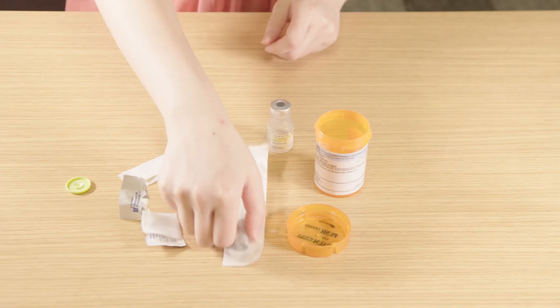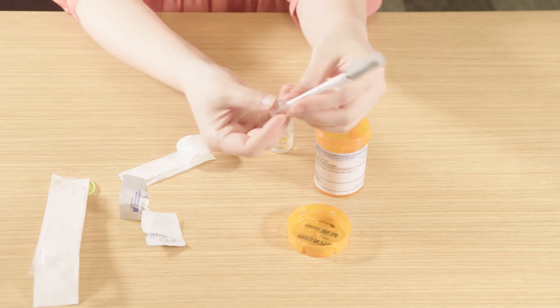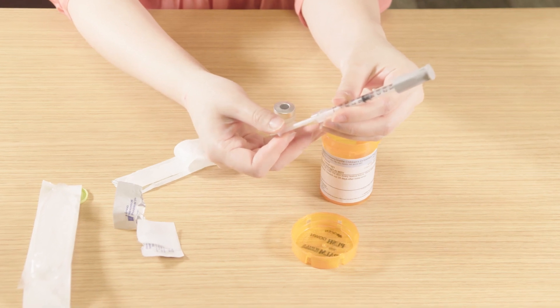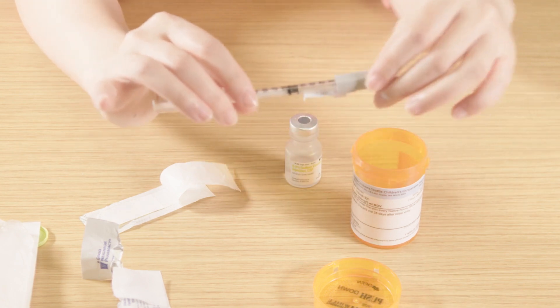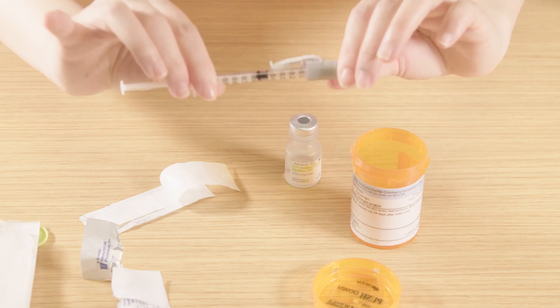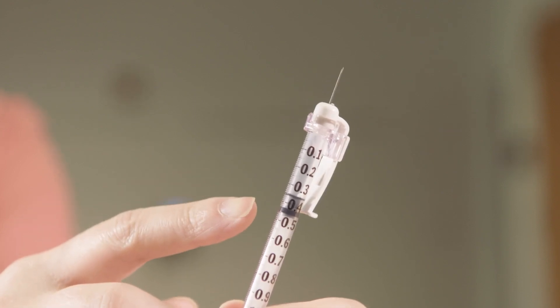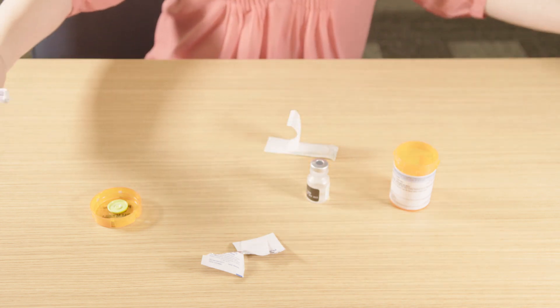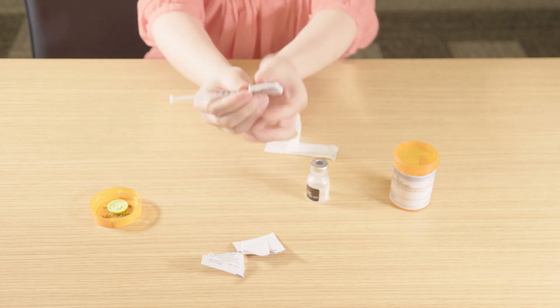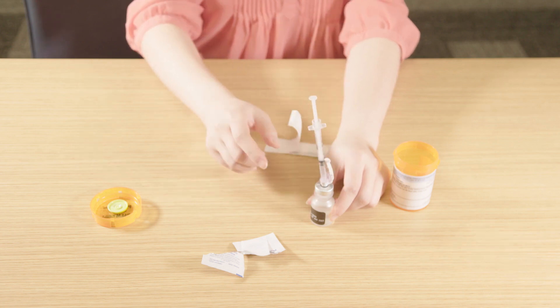Unwrap your band-aid. Next, unwrap your clean sterile syringe — you can use these only once. Pull air into the syringe by pulling back on the plunger. The amount of air should be a little less than the amount of medicine you will draw out of the vial. Do not draw up more air than the dose, because this may cause medicine to leak from the vial. For our example dose of 0.37 milliliters, pull back to 0.35 milliliters. Remove the syringe cap, making sure there is plenty of space so the needle does not poke anyone. Use a sweeping motion to remove the cap. Stick the needle straight down into the vial while the vial is sitting on your workspace. Avoid bringing the vial up to the needle, as this can increase the risk of needle stick injury.